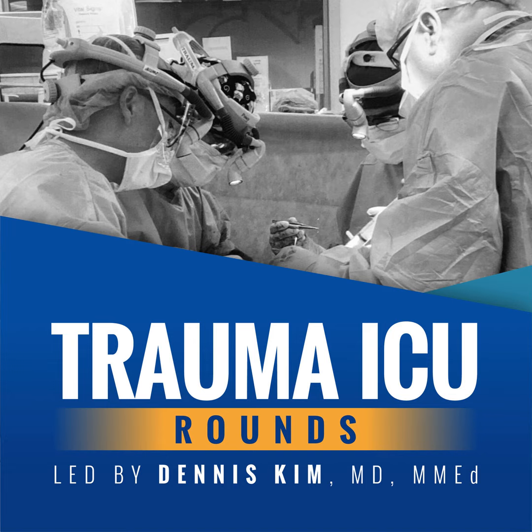In the process of determining if a patient is ready for an SBT through the application of these criteria, one of the major advances is our recognition of the importance of tying spontaneous awakening trials, or interruptions in our sedative drips, also known as SATs, to SBTs. Both observational and randomized trials demonstrate that protocols directed at minimizing the use of sedative infusions shorten the weaning process as well. Specifically, approaches intended to avoid oversedation, again, target a RASS of 0.